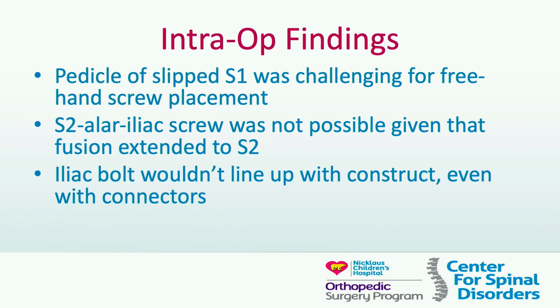And then intraoperatively, obviously, for those of you who've done high-grade spondies, that slip vertebra, getting a pedicle screw in that vertebra is incredibly difficult because the vertebra is well anterior, and being able to get predictably good fixation in that pedicle can be a challenge. With navigation, that's not usually the case.